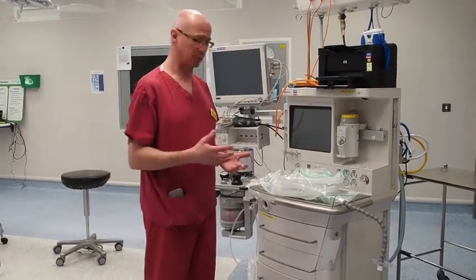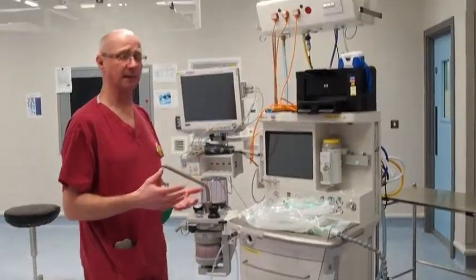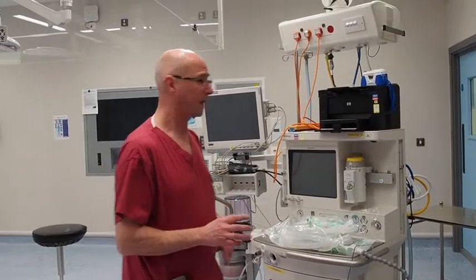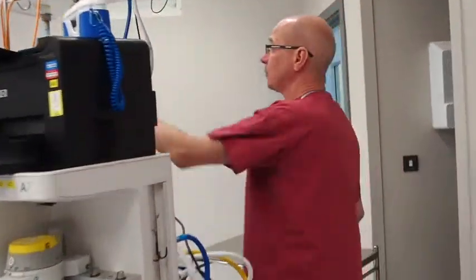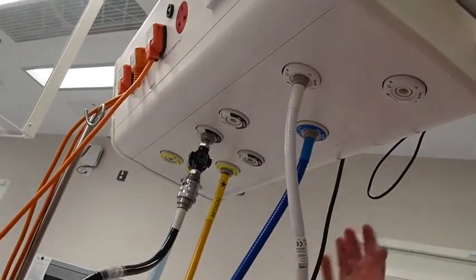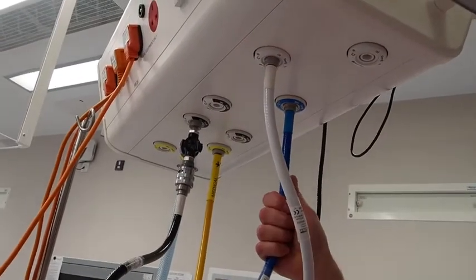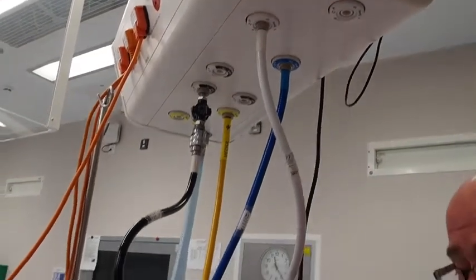So you're going to approach the machine and you may find it completely turned off, and hopefully we'll have lots of anaesthetic assistants around who can sort this out for you. But if you need to start it yourselves, you start basically the way you would with an ICU ventilator. You've got an air hose and you've got an oxygen hose, a vacuum hose for your suction, scavenging, which will need to be plugged in, and this blue hose is for nitrous oxide, so don't worry too much about that, but it's easy if you just plug all the different hoses in.